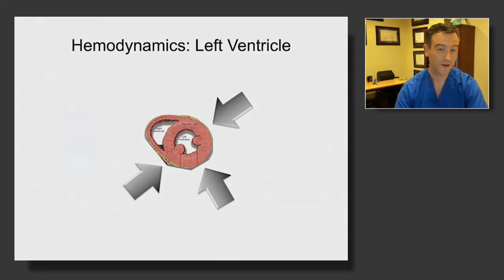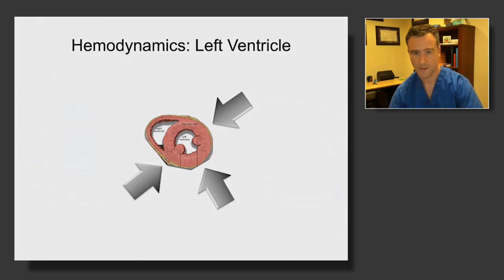And in particular, once you take a patient off of a ventilator and put them on a spontaneous breathing trial, now instead of having positive pressure pleural swings, they will have negative pressure pleural pressure swings. And so this can dramatically increase afterload, because your pleural pressure can go from positive 10 to minus 20, minus 30 if you develop respiratory distress. So that's a 40 centimeter of water swing in pressure. That's a significant increase in left ventricular afterload.